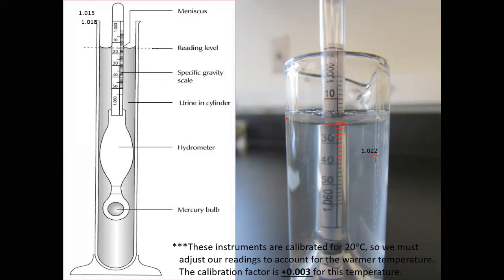Okay, so you're looking for the irregular variables and assigning a possible diagnosis to each of the 6 individuals that we have analyzed today, based on the results you got in your readings of the strips and the specific gravity.